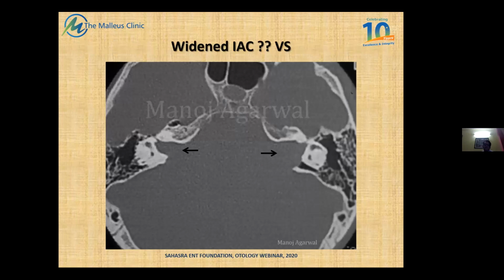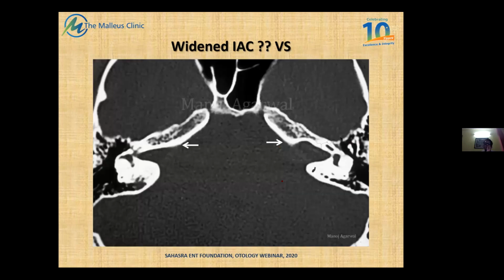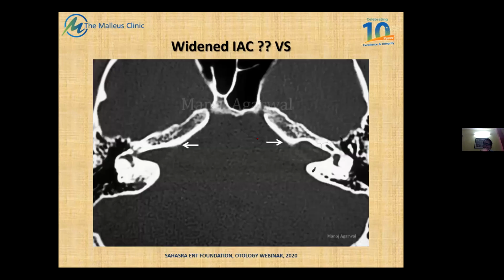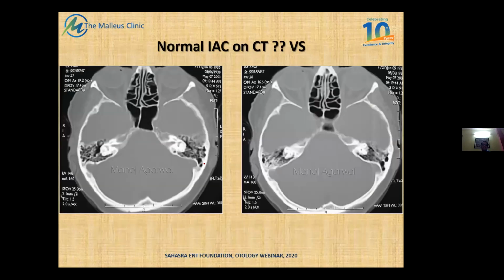Now, remember, a widened IAC, is it always synonymous with vestibular schwannoma? Maybe, maybe not. Why? Because obviously this definitely is pathological. But more important than that, the reason I have put these slides is because of this slide.